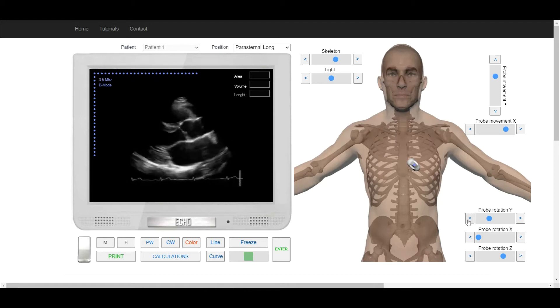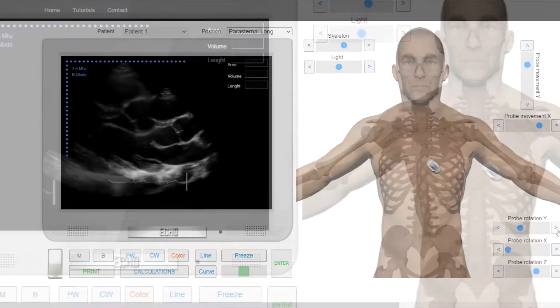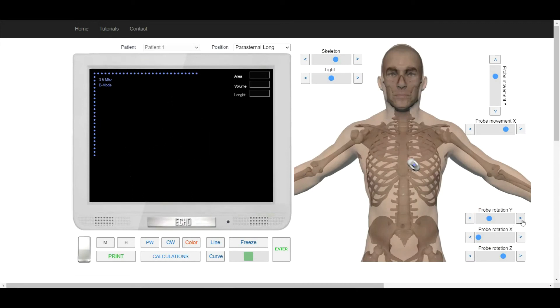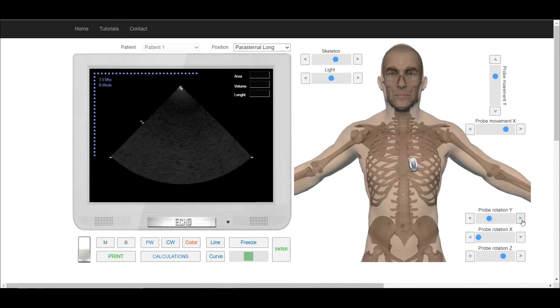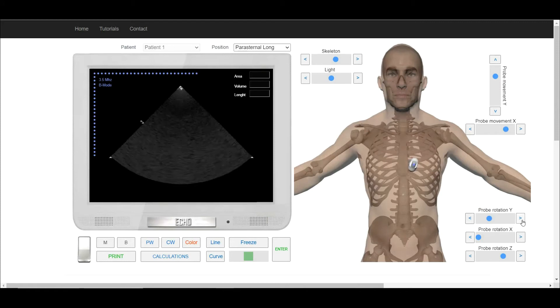The exact orientation depends on the axis of the patient's heart. Now rotate the transducer clockwise until we see on the screen the short axis at the level of the aortic valve.